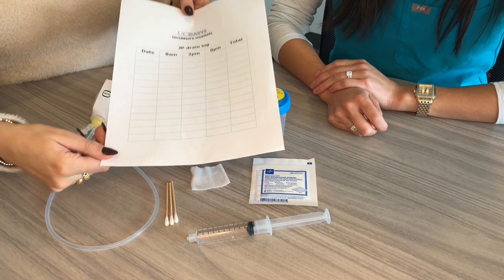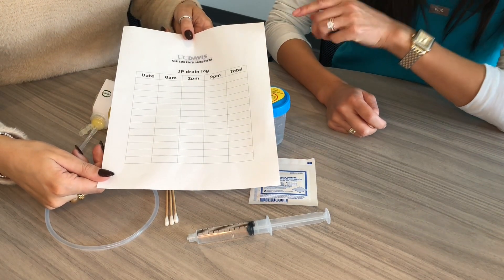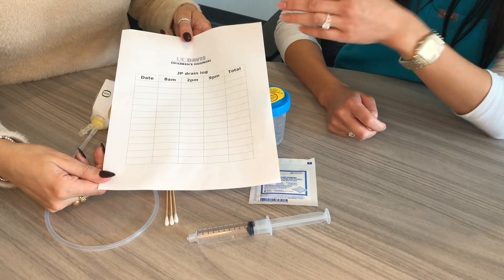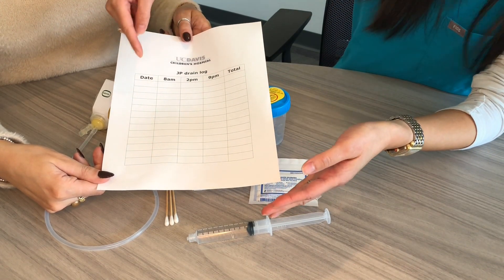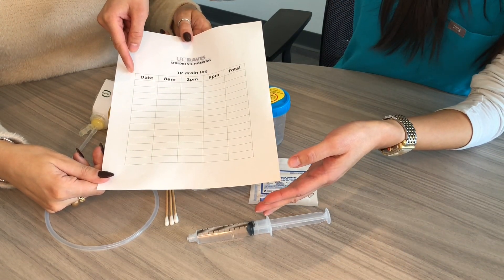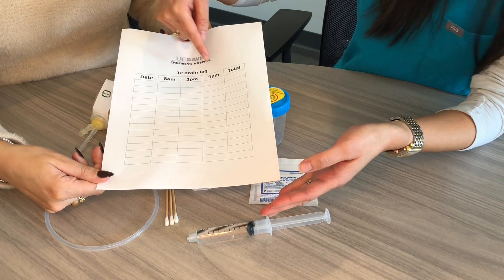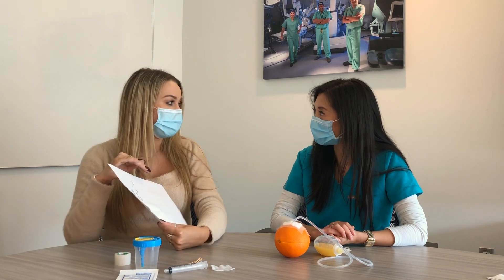In addition to the supplies, you'll also need to keep a paper log, which is where you keep track of the details of your drain care. It will look like this with separate columns where you'll provide the date, how much is coming out of the drain each time you empty it, and what the drainage looks like. So now I have my supplies and my log — what's next?